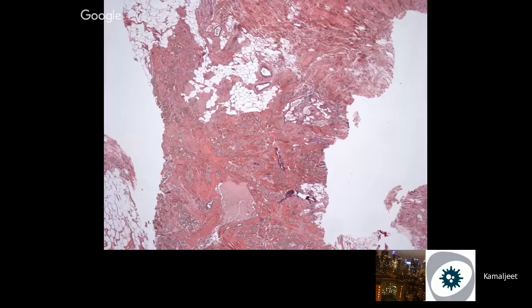This is in a biopsy, so apparently there has been discussion: do you really need to excise it? If it's a target lesion, you will get an excision, because many of these are associated with low-grade carcinomas, tubular or lobular. And what would make you suspect that? If you see tubular structures in the fat without any myoepithelial cells, you will obviously do myoepithelial stains, and they will show lack of myoepithelial cells. However, the caveat is, if the epithelial structure is within the fibroelastotic stroma, some of these can show loss of myoepithelial cells. They just inherently don't have it. So just be careful if you're doing a lot of myoepithelial stains. You cannot call it invasive unless you have an overtly infiltrative process outside the fibroelastosis.